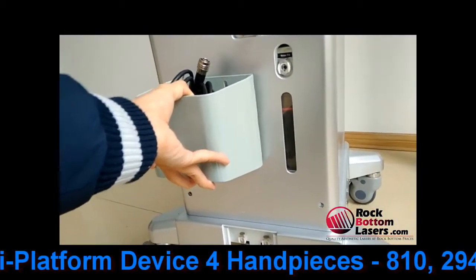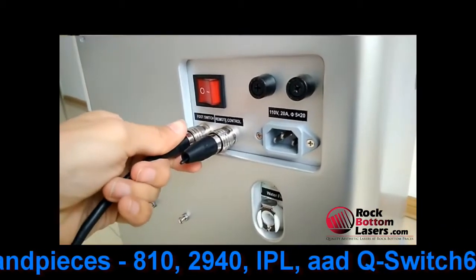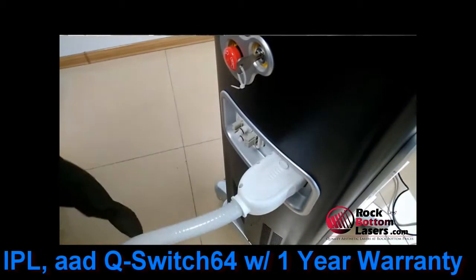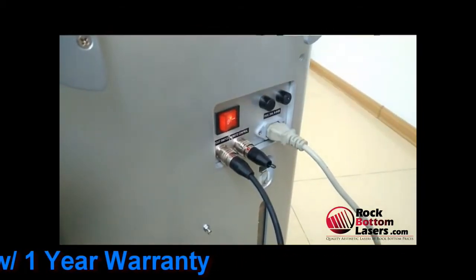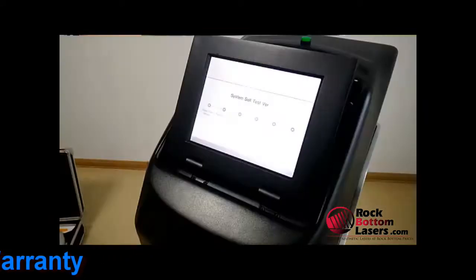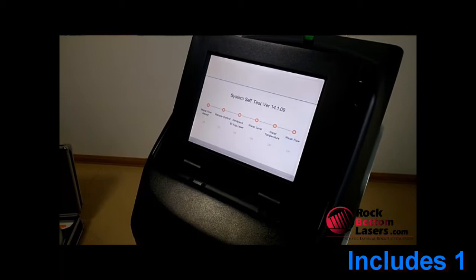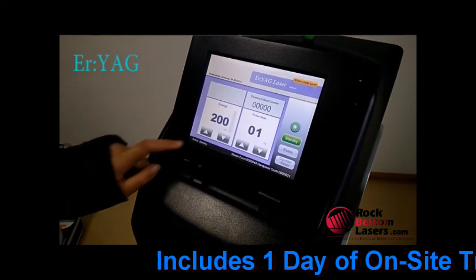This unit comes with four handpieces, so it allows you to really have an expansive practice and generate multiple streams of revenue. It includes an 810 diode for laser hair removal with a large spot size 14 by 10. It also does the super hair removal, which is really nice so you can do pain-free hair removal with your patients.